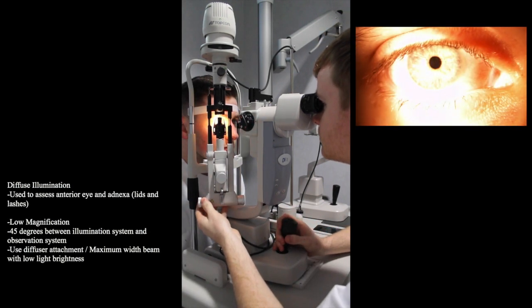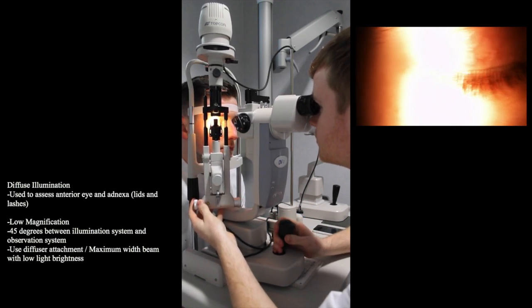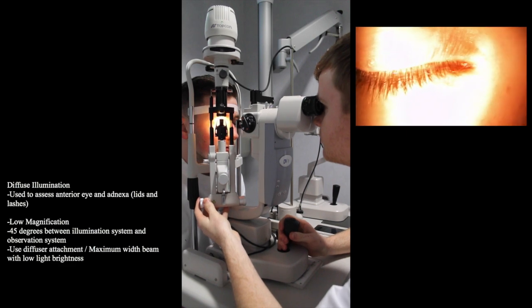Firstly, while viewing the eye we ask the patient to close their eyes to observe the lids and lashes. We then ask them to reopen their eyes so we can investigate the anterior eye.